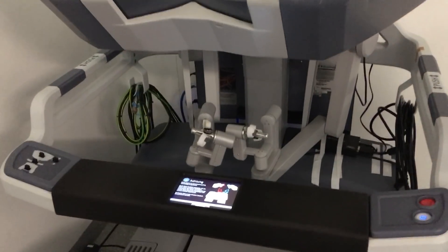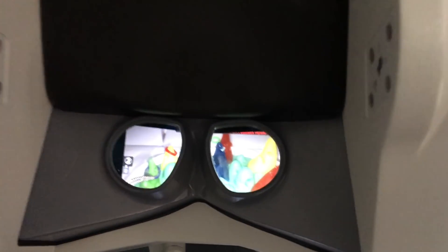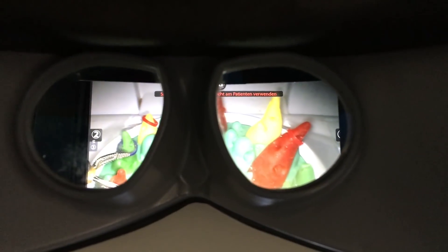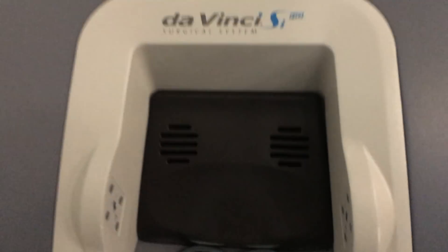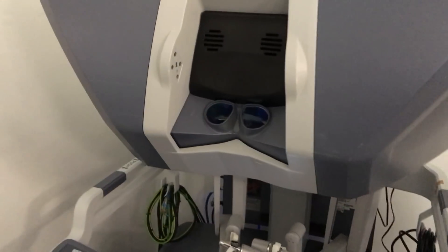The operator's console — you're looking through these lenses here like through a microscope, letting your arms rest on the armrest and operating the instruments like two tweezers.